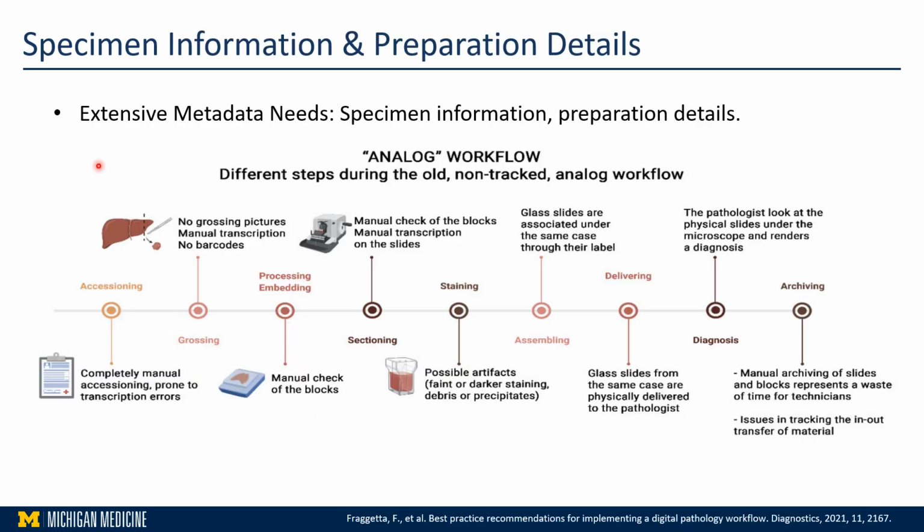So before we dive into digital pathology and machine learning modules, I would like to emphasize there are extensive steps in order to prepare that glass slide, starting from accessioning the patient and everything in pathology. As we all know, it's a specimen level, not patient level, in the beginning. So after you accession, you will receive the specimen and prepare the specimen, called grossing.